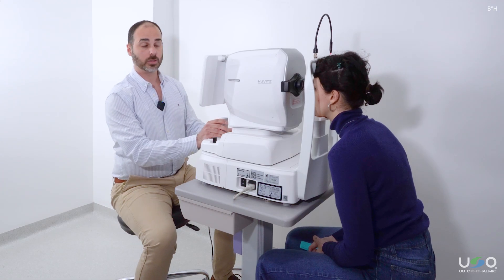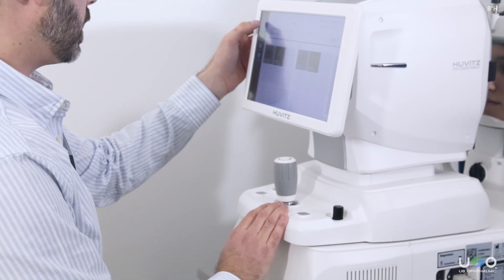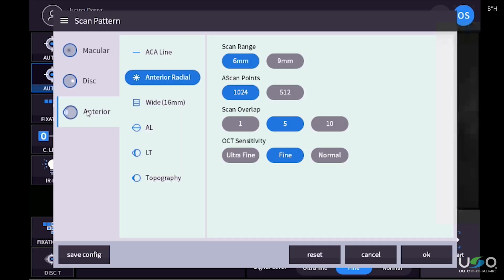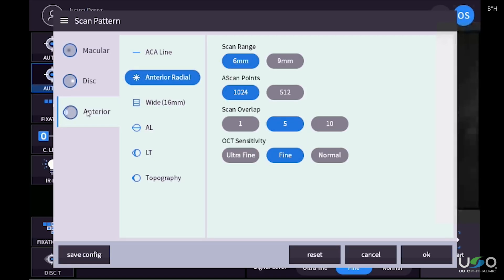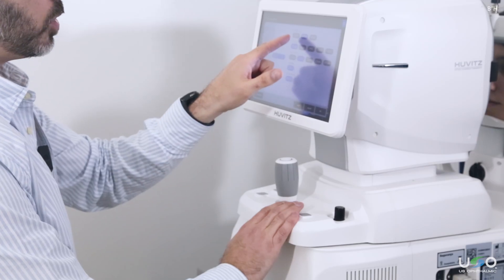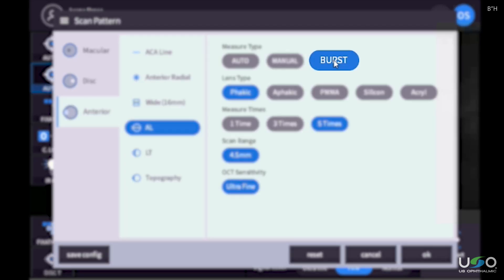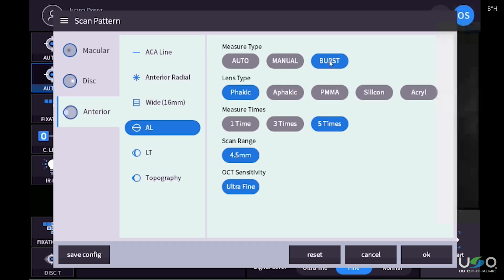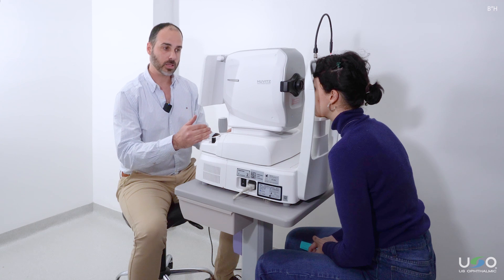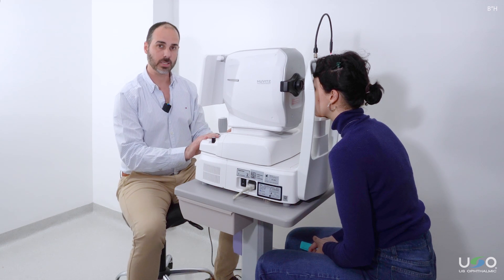When we need to do a biometry reading, once we have the patient selected, we will go to the measurement screen, then to anterior segment where we can choose axial length and lens thickness. First, we are going to choose axial length. We have three modes: auto, manual, and burst. The one I recommend using is burst mode, which will allow us to make a sequence of automatic measurements once we have the measurement position selected.